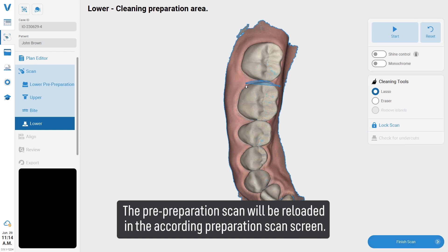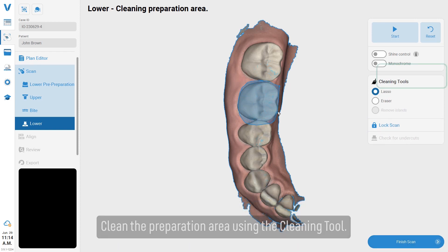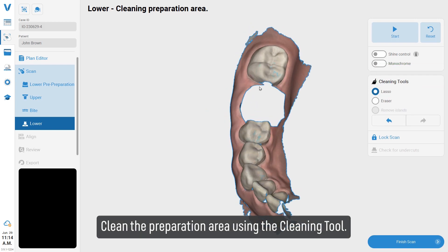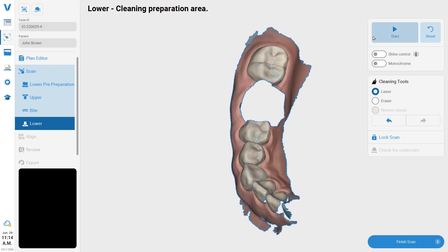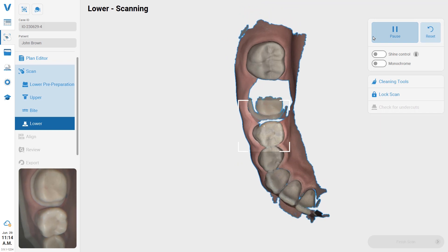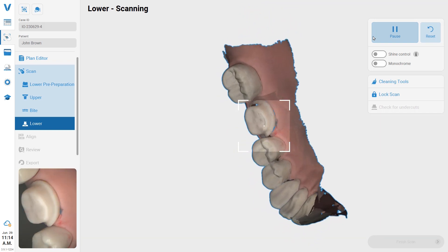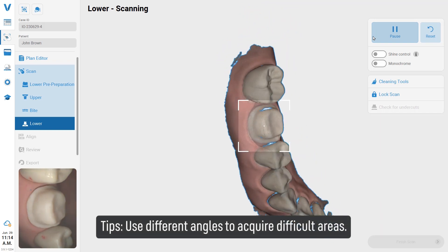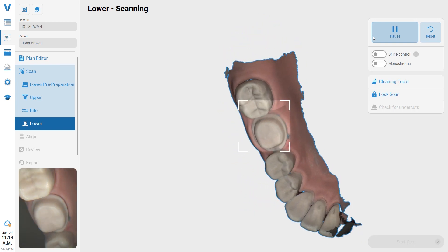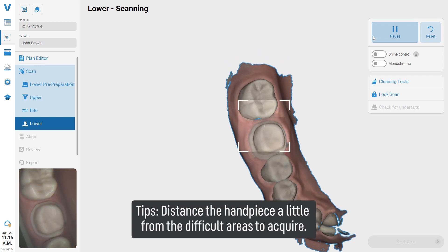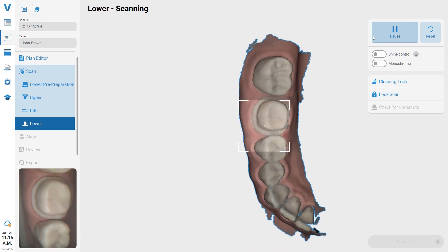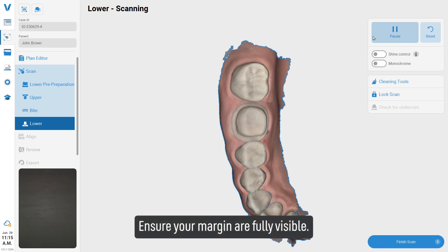In the preparation scan screen, clean the preparation area using the cleaning tool. Start the scanner and scan the preparation area. Use different angles to acquire difficult areas, and distance the handpiece slightly from difficult areas to ensure your margins are fully visible.